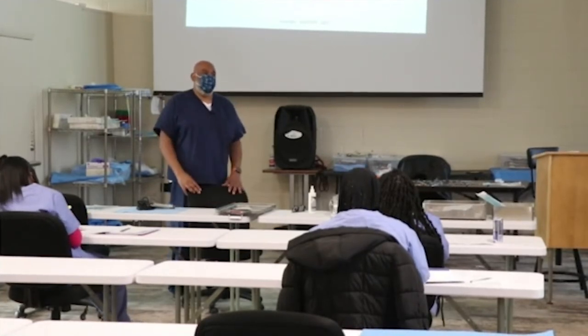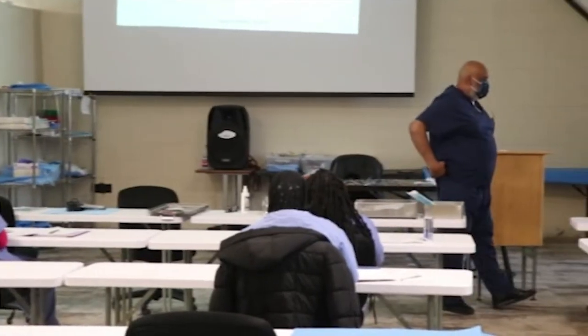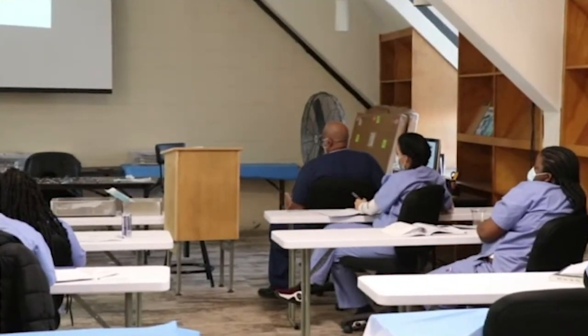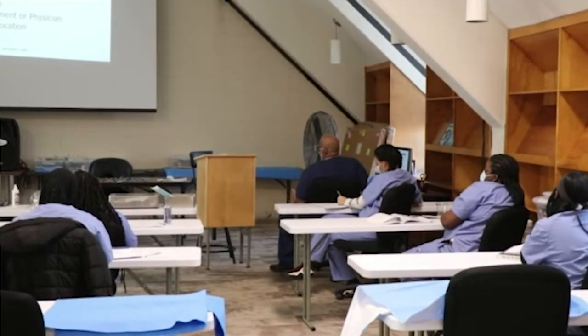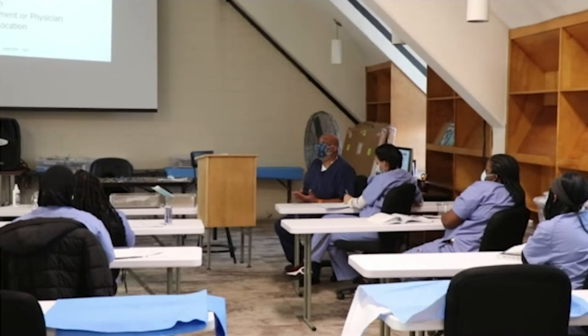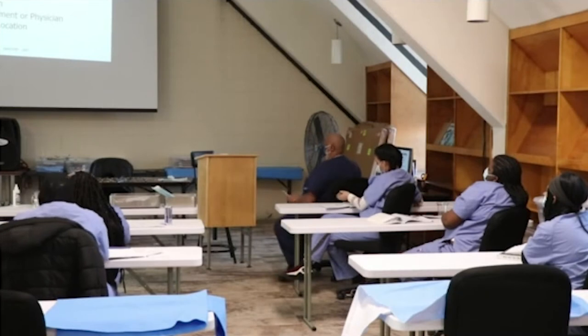Communication between the three is very important. Storage is an issue in almost every hospital, but it's so important, guys, location, that we put things where they properly belong. Because when they go looking for it, they need it for a case, or it's a one of a kind tray. This is the benefit of the automated system. The systems are only as good as the people who use them, right, Jessica? That means if you scan it properly to the shelf, to the right location, then when they go looking for it in the system, it should be in the right place, provided that CC and them put it back where it belongs. One of the challenges we face is we're not the only ones that have access to it. The nurses could come in and grab something and not scan it.